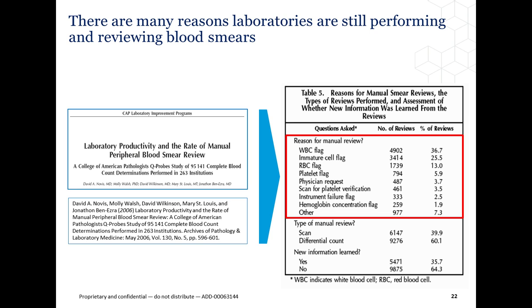However, laboratories continue to report the manual reviews and differentials are still one of the most important criteria when choosing a new hematology analyzer. And they see the time-consuming and labor-intensive manual diff as the primary impediment in further streamlining their much-needed labor savings. The need for manual reviews and differentials is based on many reasons.